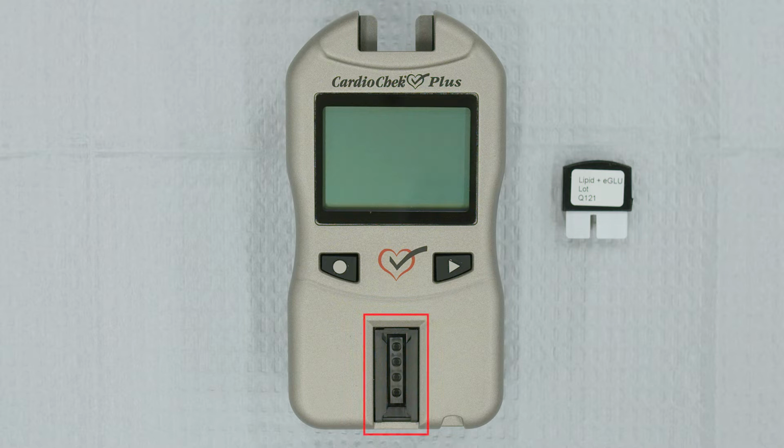The Reflectance Test Strip slot is where you'll insert the gray check strip when checking the analyzer's electronic and optical systems, and your Reflectance Test Strip when it's time to run a patient test. The Electrochemical Test Strip port is where you insert the PTS Panel's eGLU test strips. The USB port allows you to connect to a PTS Connect printer.